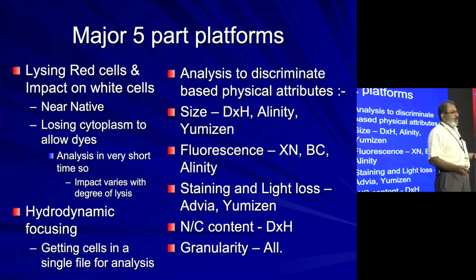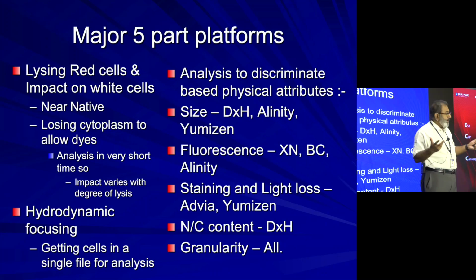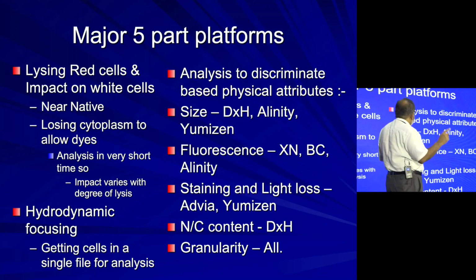See, the Sysmex is not interested in size at all, because all their life they realize that the cell is going to be small anyway, so there is no time to waste on size. But I'll show you that we can still waste time on that.